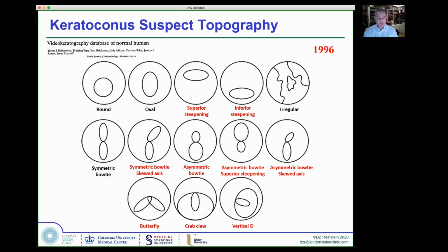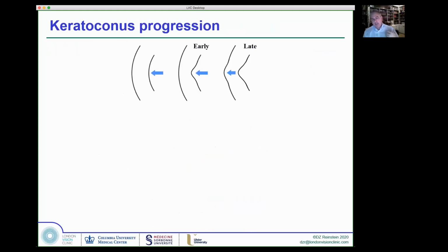And between experts, it was one of these, oh, well, in my experience, John, I think this, and what do you think, Jack? And it was all very opinion-based. Like I said, the standard barn door keratoconus on topography is the inferior steepening picture. But some of us started using a device called the Orbscan, which was a tomographic device that enabled us to get the back surface shape as well. And I was privy to having one of these machines in my fellowship in 1996, 97.